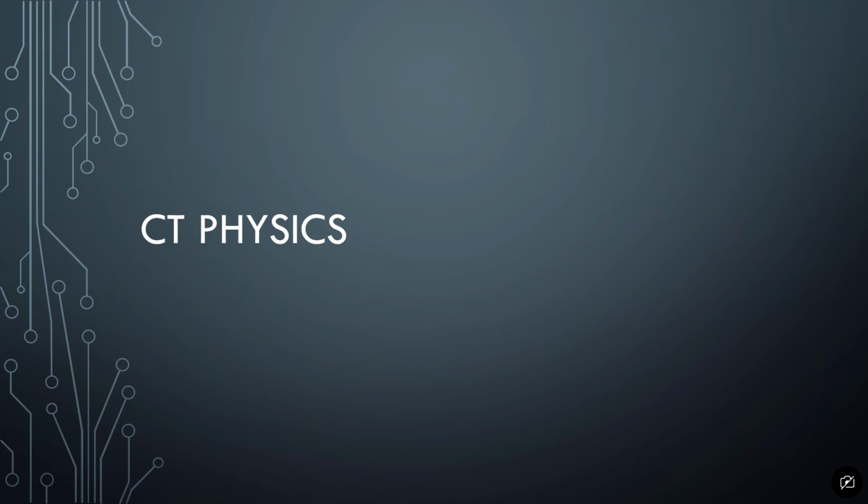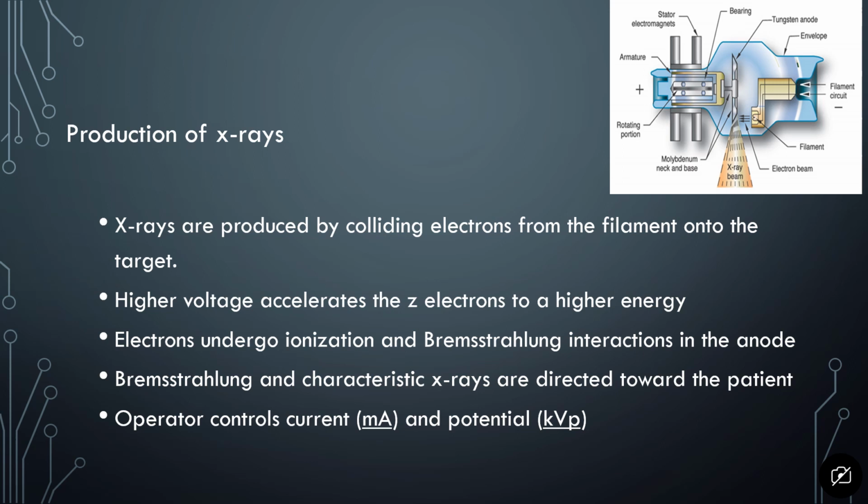Hey everyone, welcome to this video on the CT physics. This video is meant to be a short review. So first we're going to talk about the production of X-rays. There's an image there of an X-ray tube.